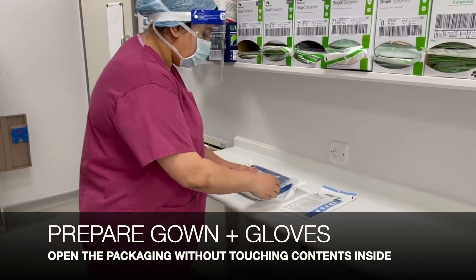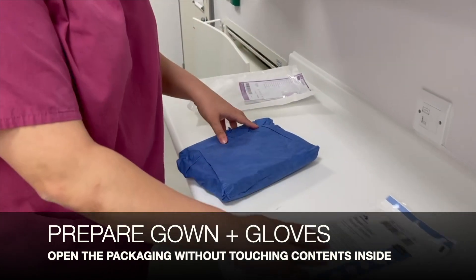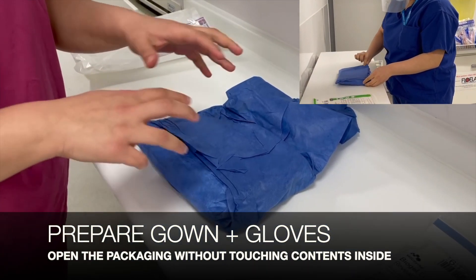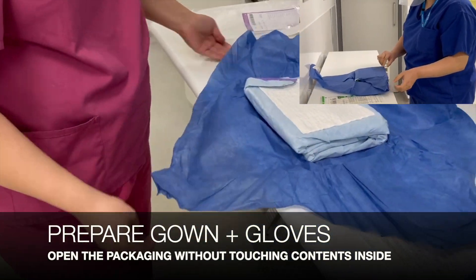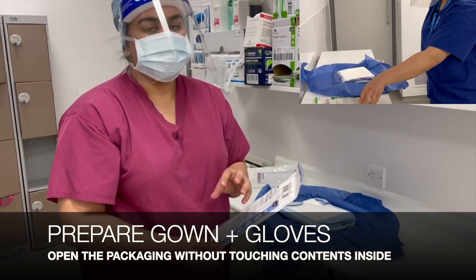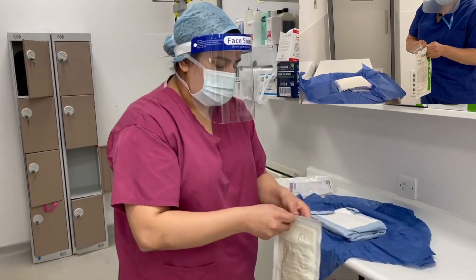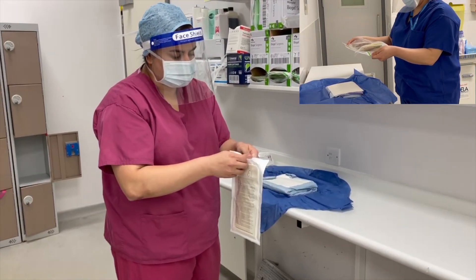Now we're ready to prepare the gown and gloves. We're going to open the packaging for the gown, which is surrounded in a dark blue cover. Using the tabs on the edge of the cover we're going to open it, making sure we don't touch the insides at all. Then we're going to open the double gloves — the inner glove will be the larger glove and the outer glove will be the normal size — opening the packaging at the top, making sure not to touch any of the inside packaging.